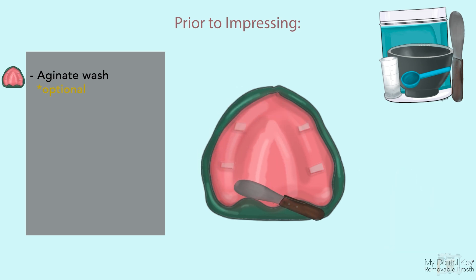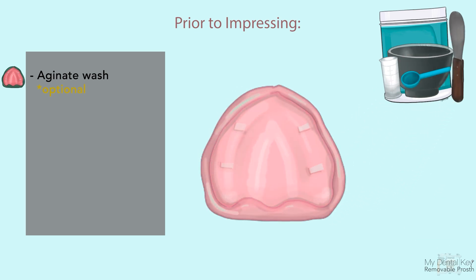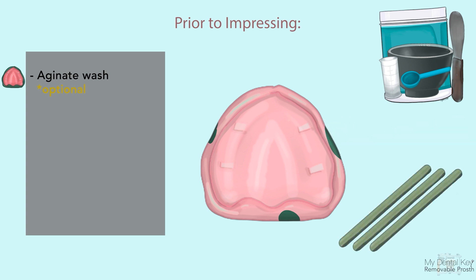You do not need to use adhesive when performing an alginate wash. Simply apply alginate to the border-molded tray and insert as if making your final impression. Upon setting, remove the alginate wash and identify areas that are overextended, then trim them using a scalpel or sharp instrument. If you have areas that are underextended, repeat the border molding procedure in that area before proceeding.